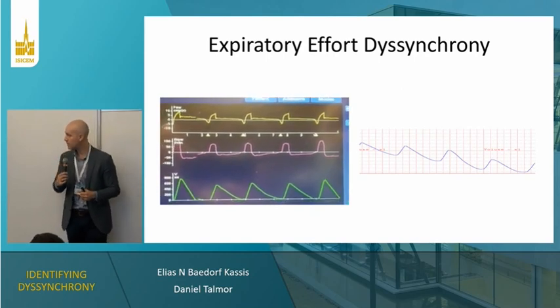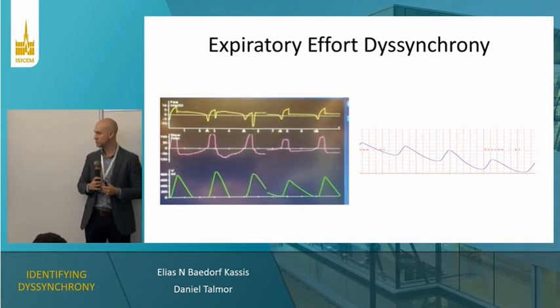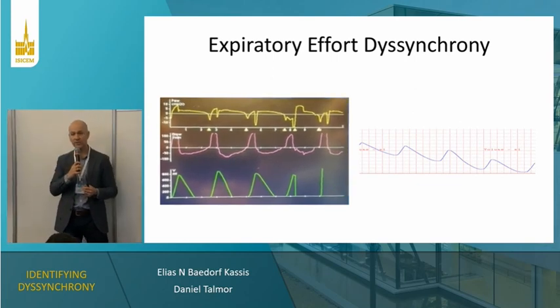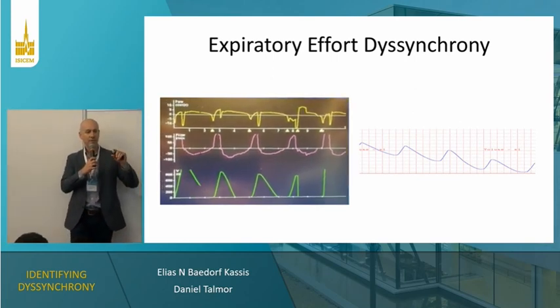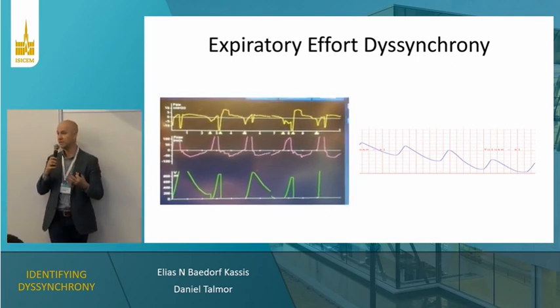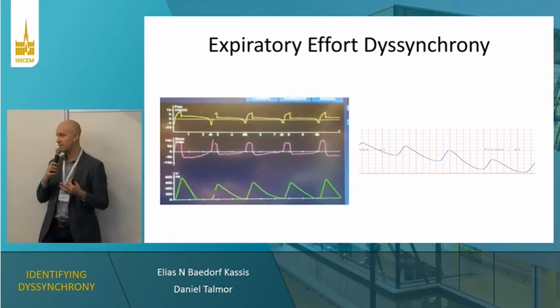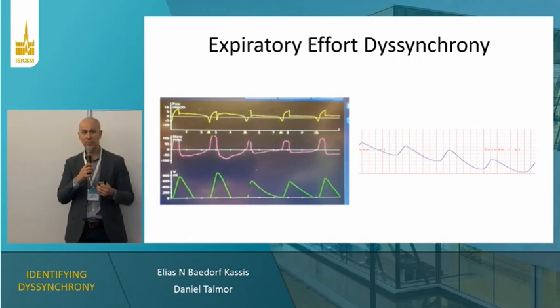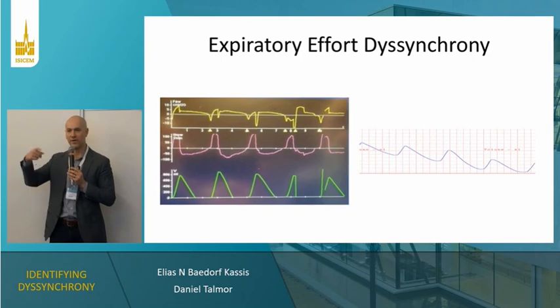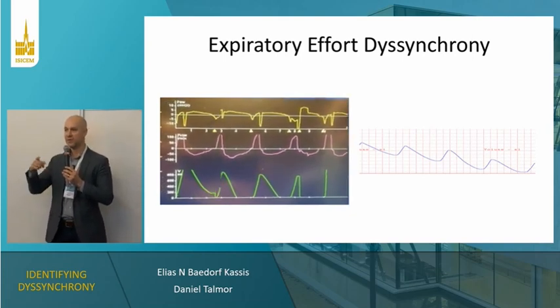And you can see that nicely here as the volume decreases as they continue to push against the ventilator. The tracing on the right is by integrating the flow again, and you can see that the total volume decreases with each delivered breath. The concerns of this are, what is this doing to the patient's recruitment? Is the patient de-recruiting? Are they setting themselves up for atelectrauma? We've seen patients who do this repetitively over and over again, where they bear down, breathe, bear down, breathe, and they'll do this over multiple different breaths.